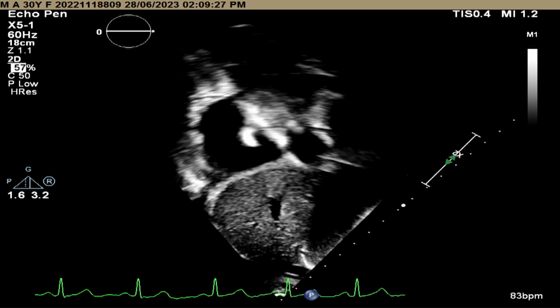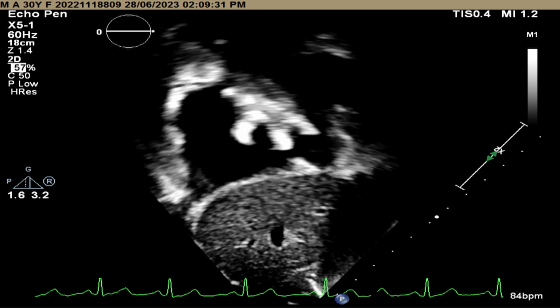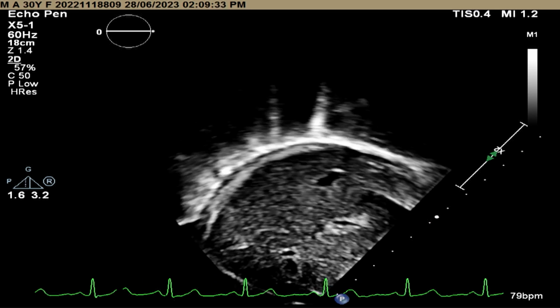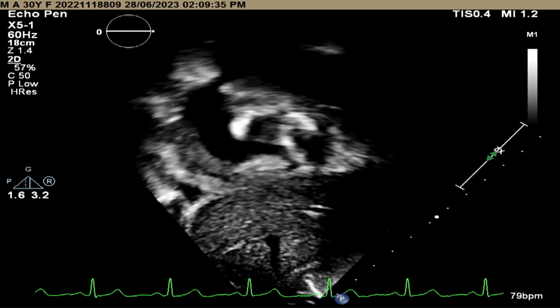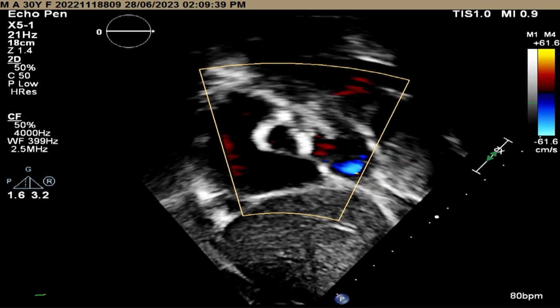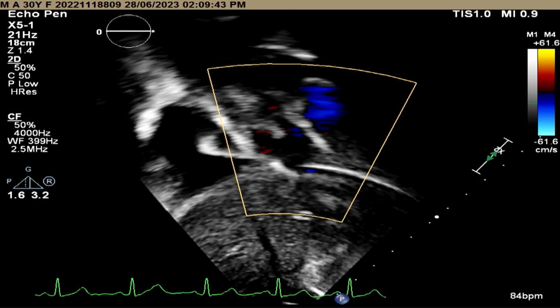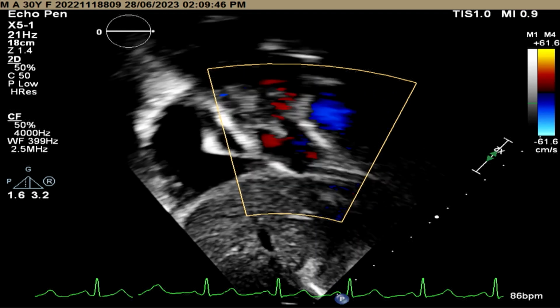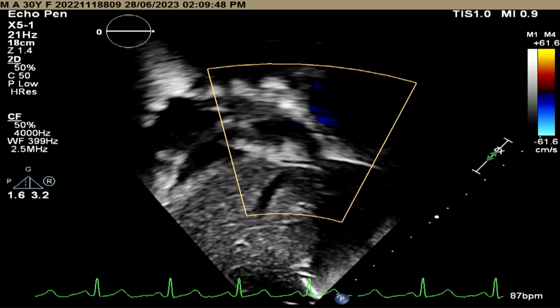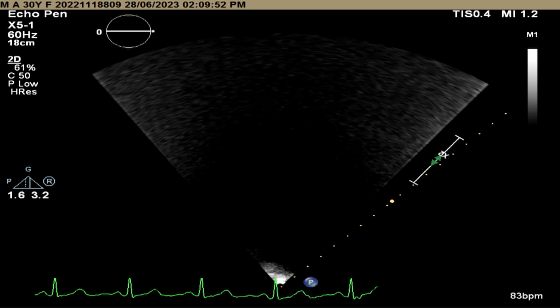Shiva, sorry for asking, from Frankfurt, I'm not quite sure about the IVC rim. Is that okay? Can you color the inferior vena cava just to make sure, as if there's a leak, a tiny leak? I'm not sure where the red color is coming from. It's going into the LA disc and just turning around. I will release it so that you will see the same pictures.